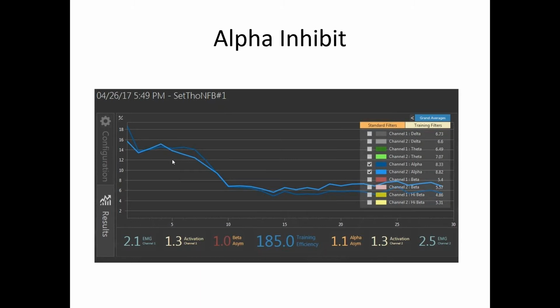The second advantage, which you would never get on the other graphs and patterns and methods of training, is you can see state changes, a la Barry Sterman, vigilance, withdrawal of vigilance, etc. But beyond that, you can see changes in mood. You can see changes in input from the reticular system in the brainstem. You can see changes of input from the limbic structures, septal hippocampal generators. You can see changes in cortical. And those together describe states and moods and cognitive processing that we use to interact socially as a species with our tribe.